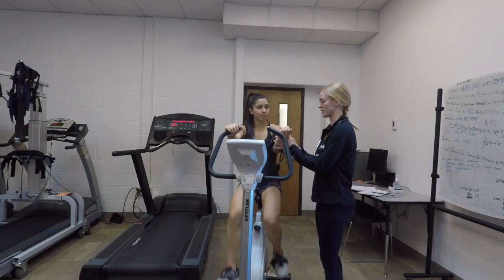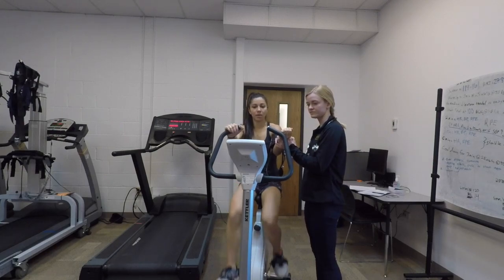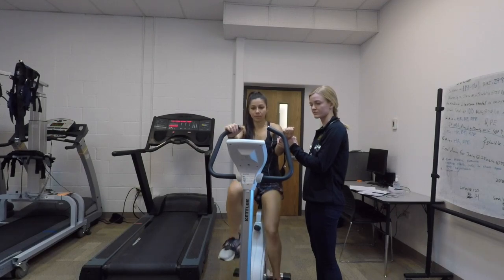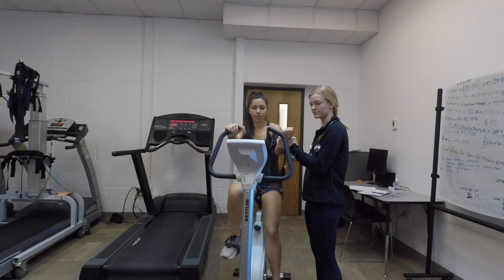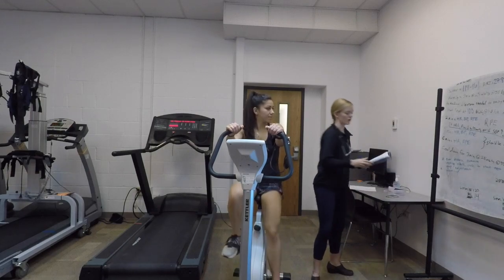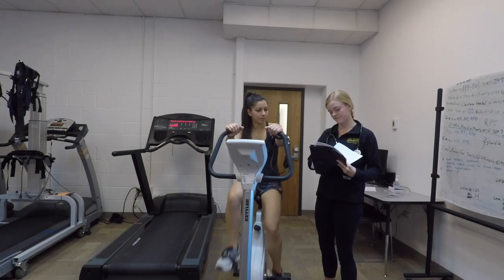If I can just grab your hand for me, thank you. And so what I did is I just used this clock on the bike and took her heart rate for 30 seconds and multiplied it by 2, and so we got 84 for that first one.